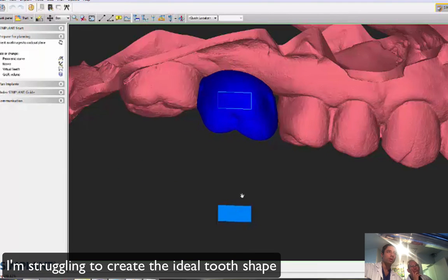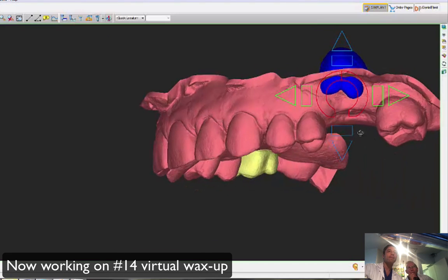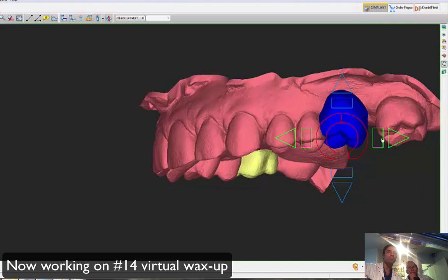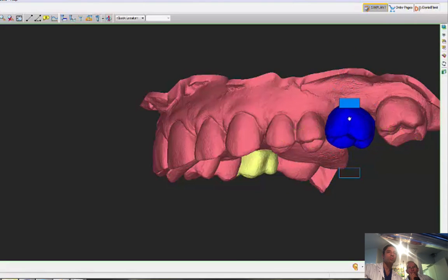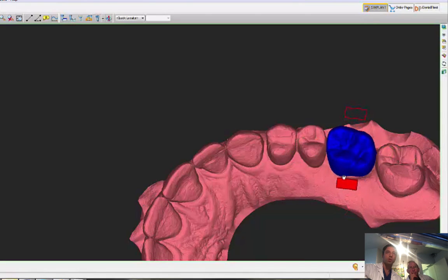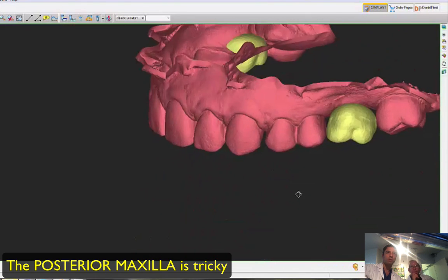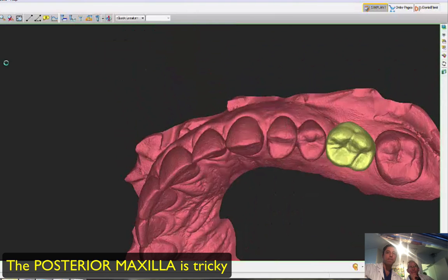In this case it's probably better to do a wax-up, but just so we have the idea. Let's put number 14 in position. I have no clue — this virtual tooth can be in a completely wrong restorative position — but just to give us an idea, just so we have something to work with.